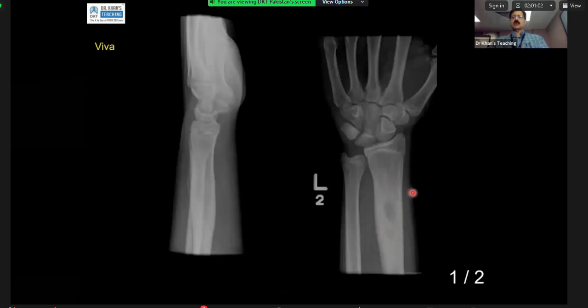So you're not very sure where is the normal and where it becomes abnormal. And the candidate did very well. But please remember that when you see a wide zone of transition, do not use the word that this is malignancy.